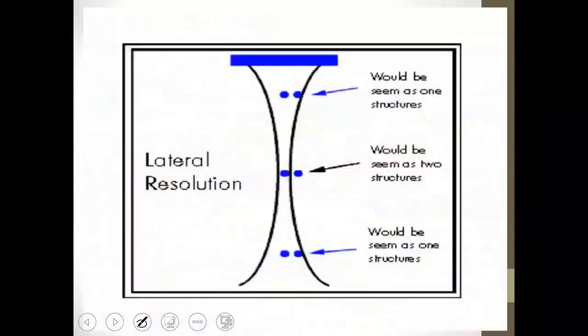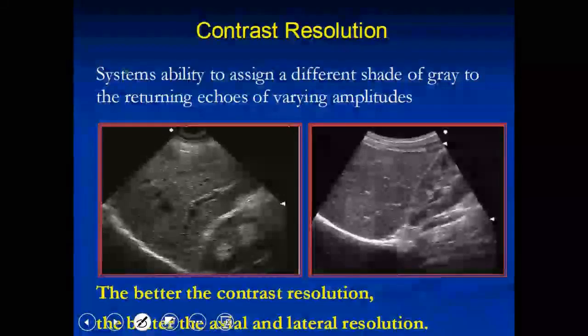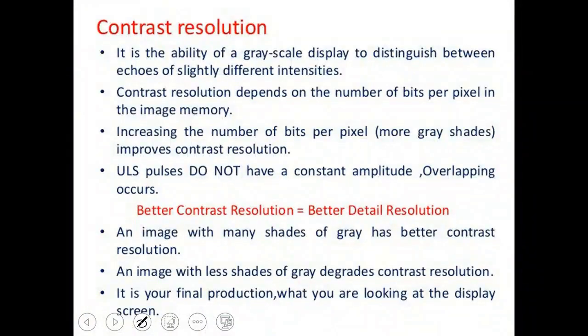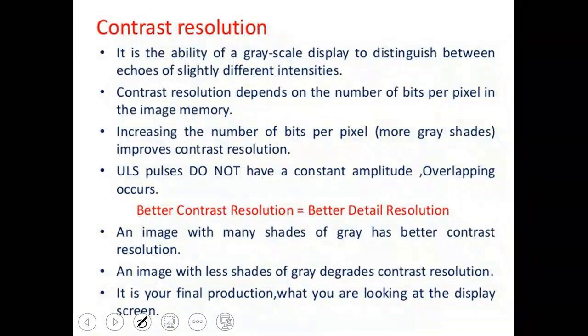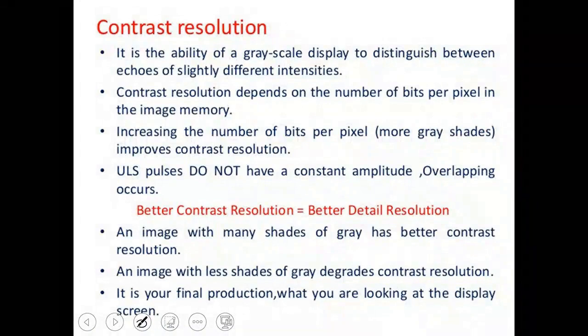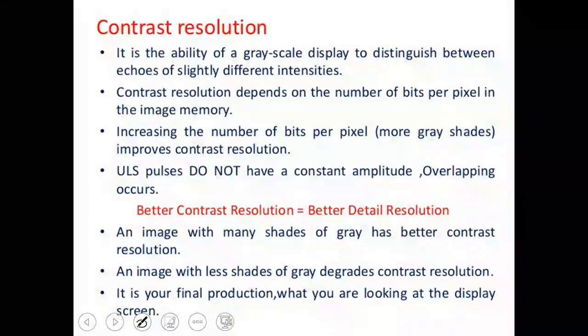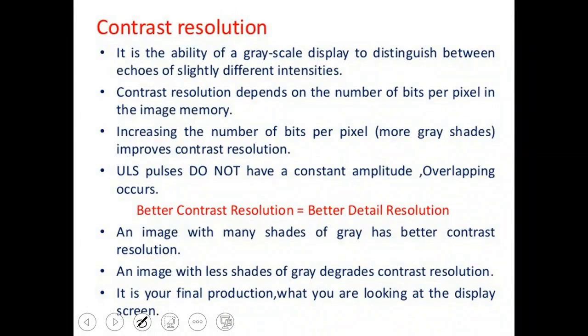There is something else, contrast resolution. We have taken contrast resolution in a previous topic. What is contrast resolution? Can someone remind me what contrast resolution means? Sorry, Dr. Basma, but this is the contrast. If I say that I have a certain object and I want to distinguish it from the background, that is contrast, or the concept of contrast.